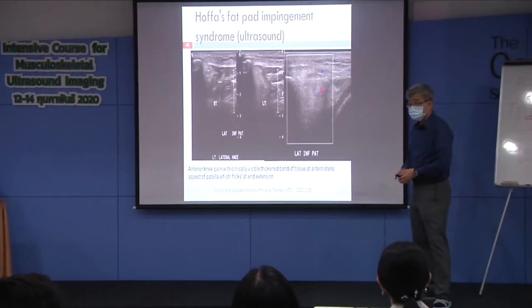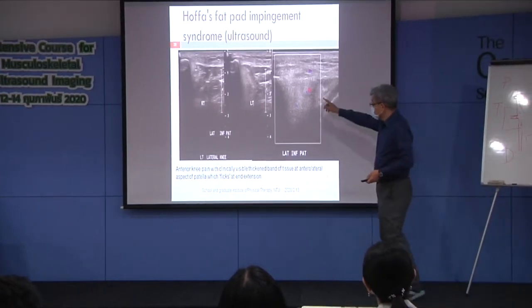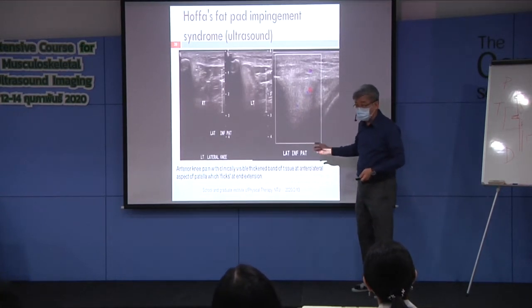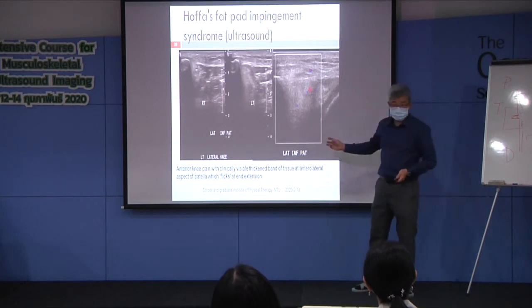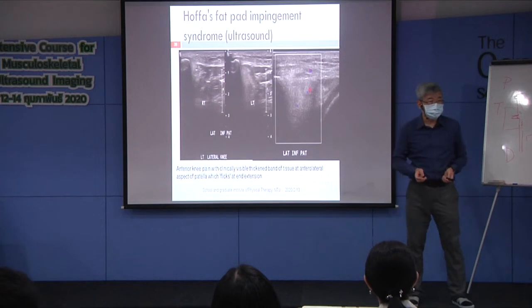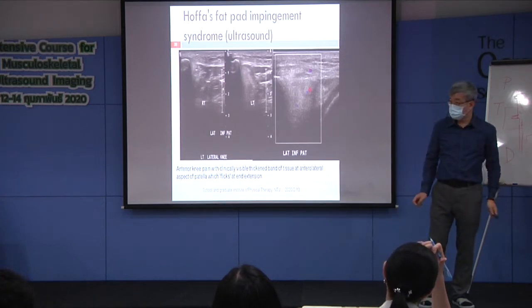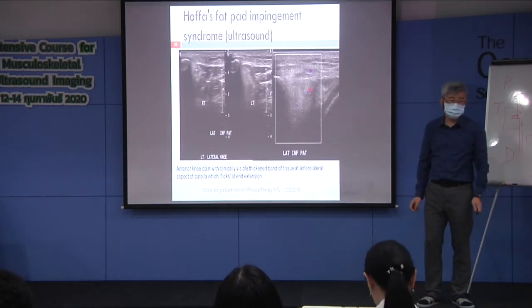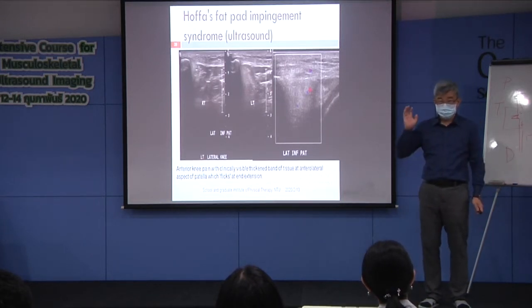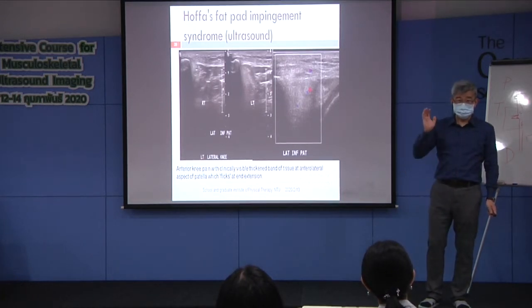And I used power Doppler to check. And yes, Professor Rolf, this is a case of Hoffa's fat pad syndrome. He looked at me and said, I told you. That is the phrase most frequently used between my supervisor and me.